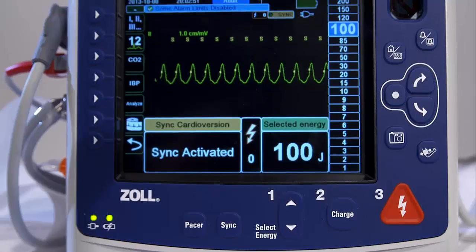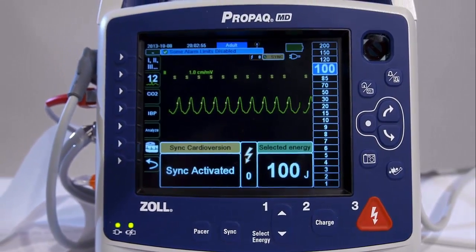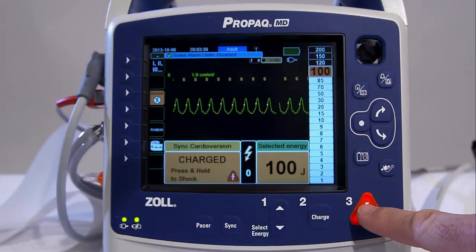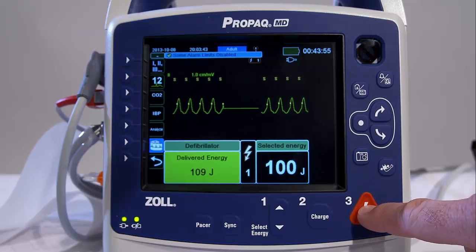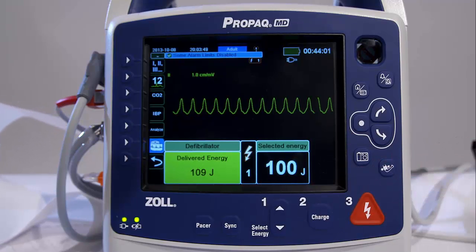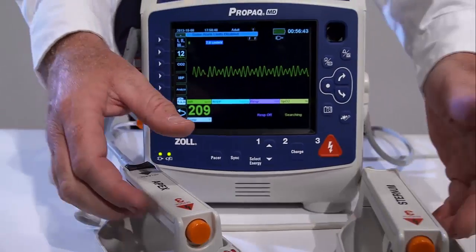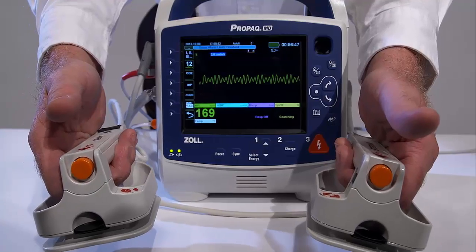Verify that the ECG waveform is stable and that Sync markers appear after each R-wave. Press and hold the illuminated Shock button on the front panel until energy is delivered to the patient. The defibrillator will discharge with the next detected R-wave. When using paddles, simultaneously press the two shock buttons found on each of the paddles in order to deliver the shock to the patient.